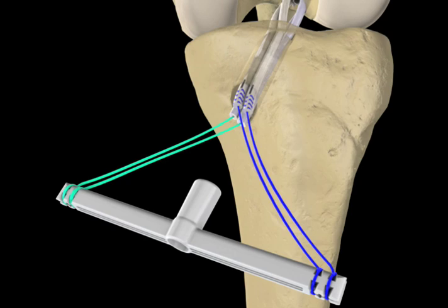The nitinol guide wire is inserted through the tendon expander, into the tibial tunnel, between the tendon grafts and into the joint space.